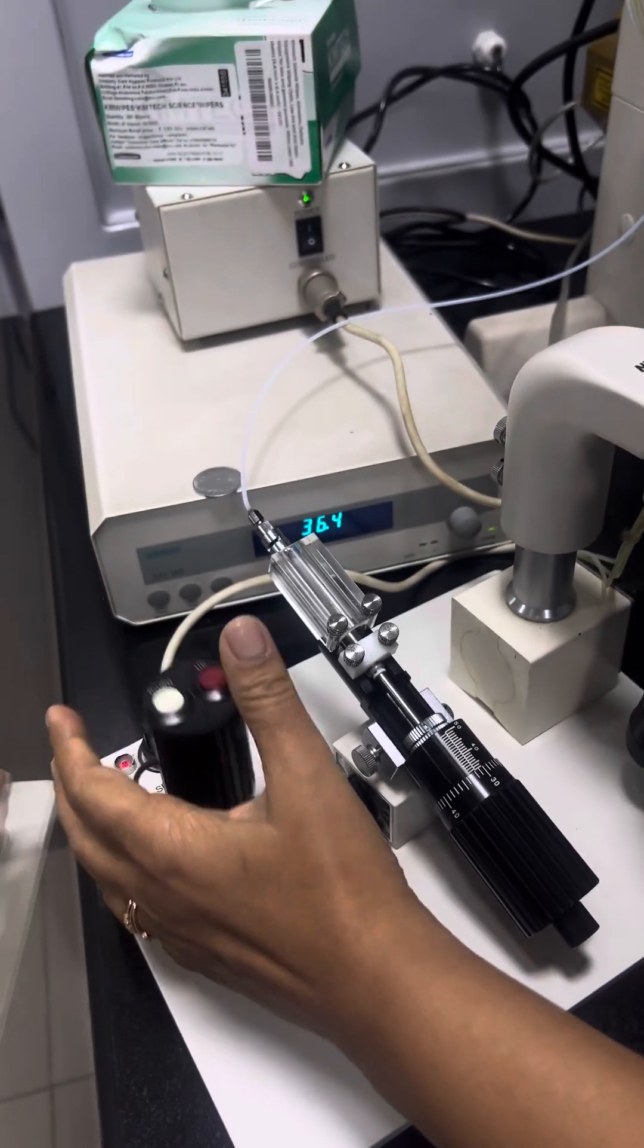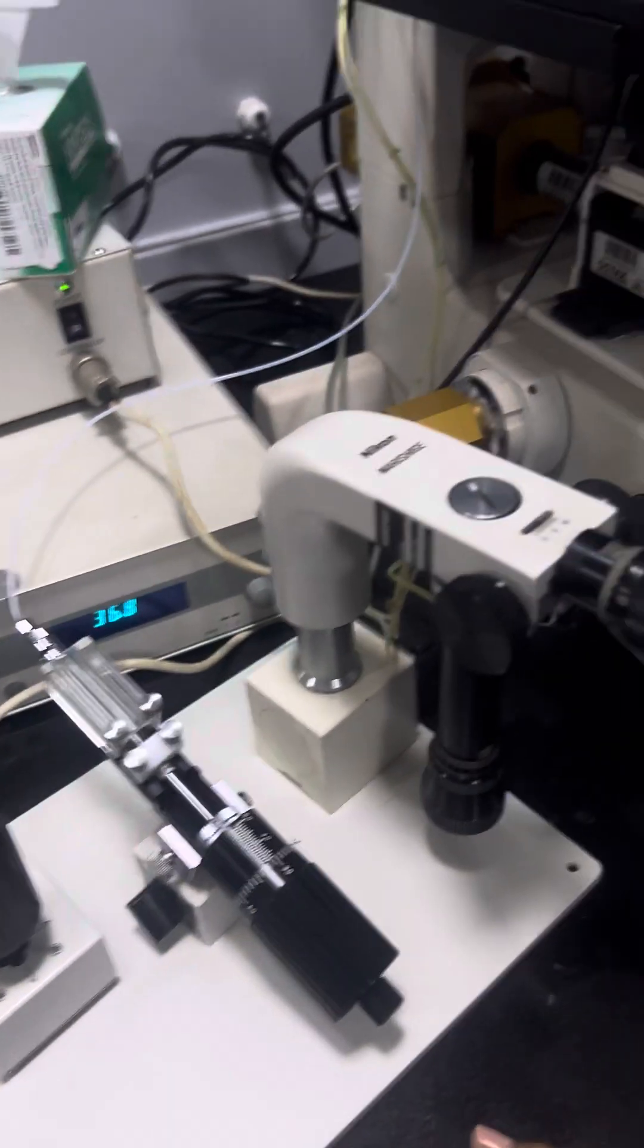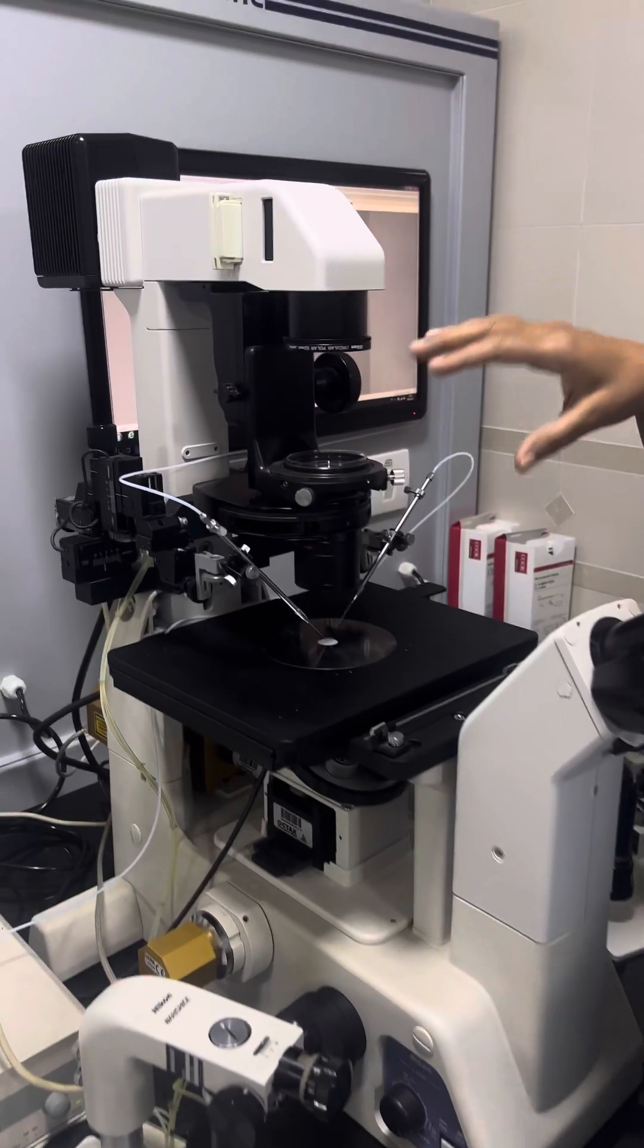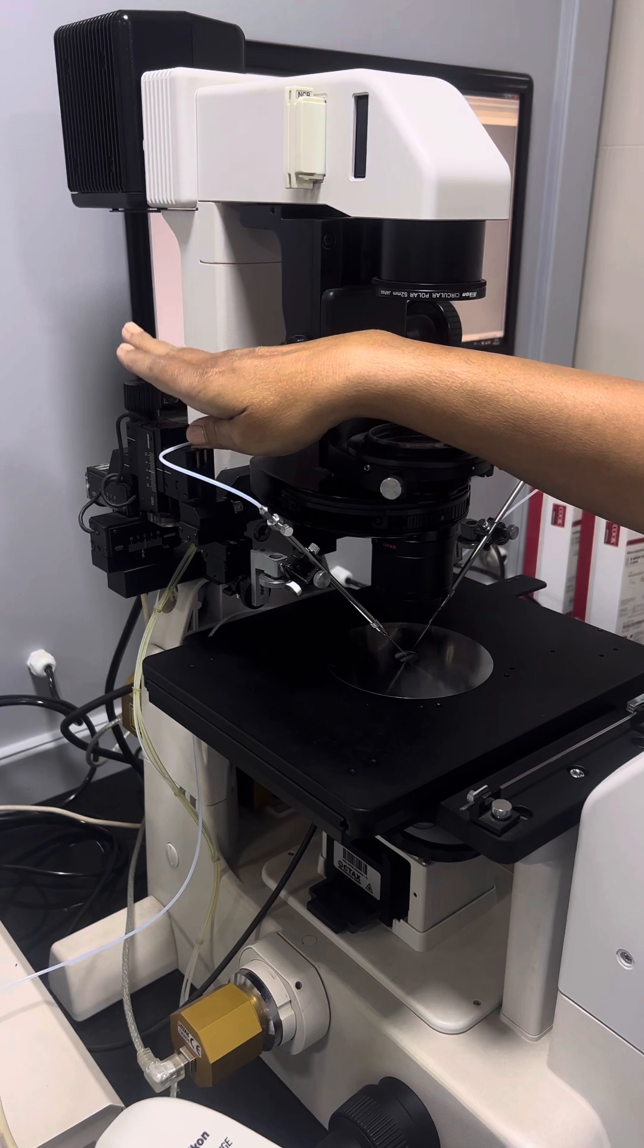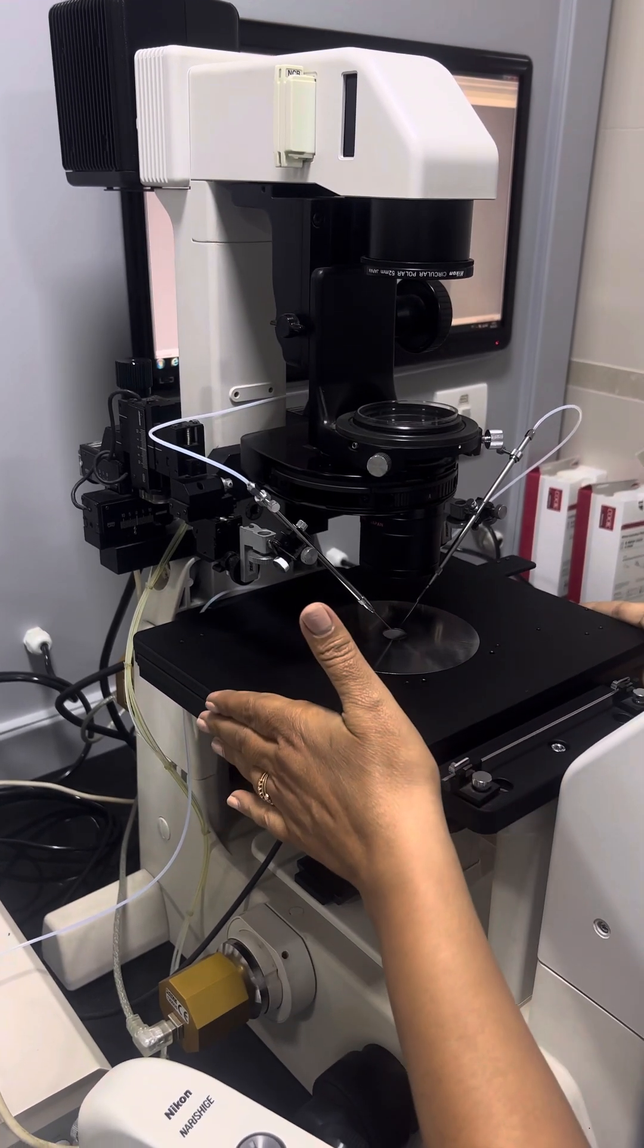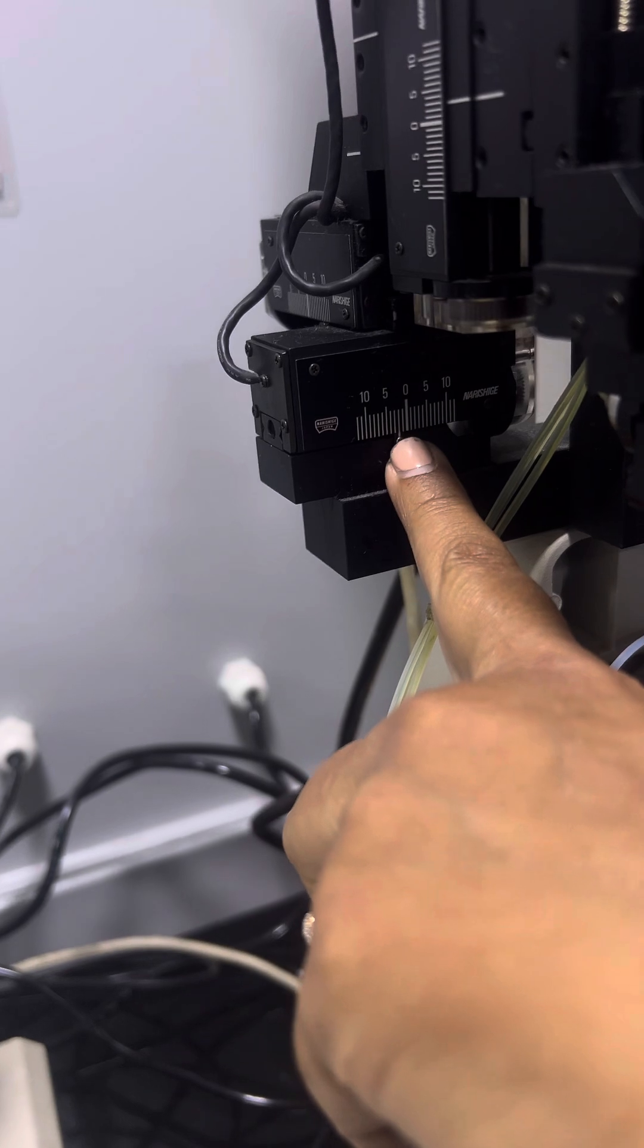This has a motor and up and down switch. And then you have to make sure that all the X, Y and Z axis on the microscope table also is on 0. It should be on 0.